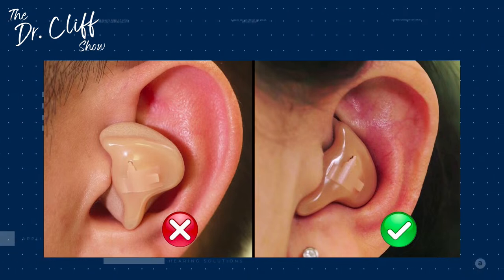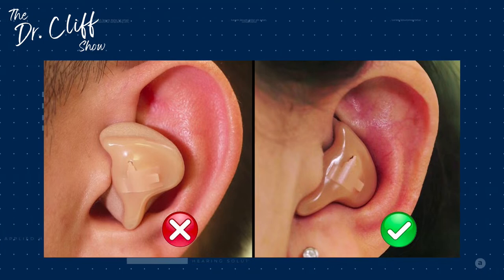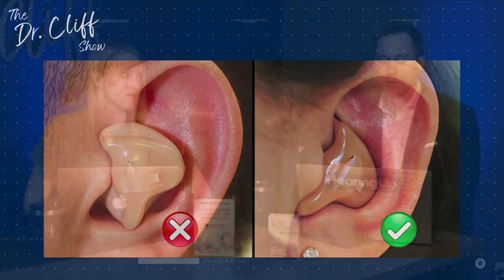But there's something that we don't see on this particular screen that is very important that everyone needs to understand, and that is the venting of an actual hearing aid. So we have the venting of a custom ear mold. We also have the venting of a rubber dome that goes inside of your ear. All of this, not just from a retention standpoint that you were talking about, the acoustic component is incredibly important to make sure that you get the right dome.